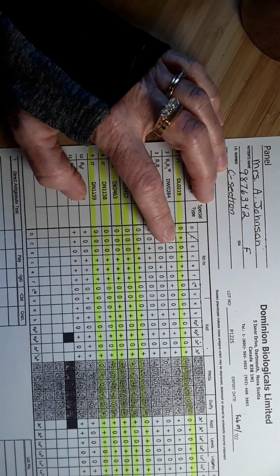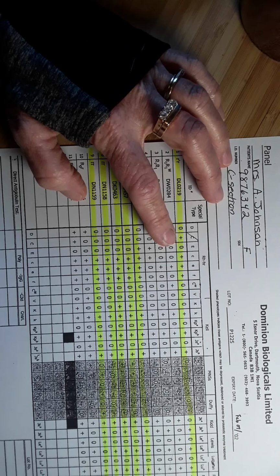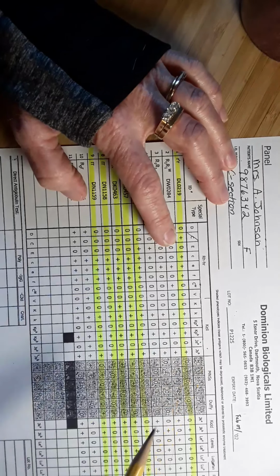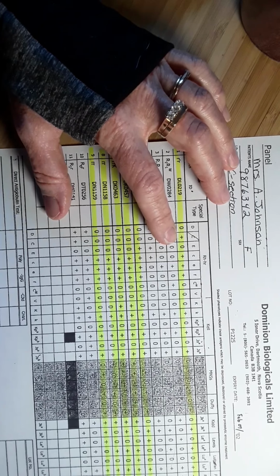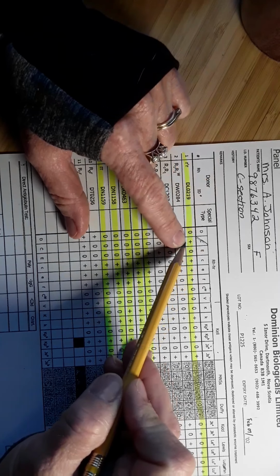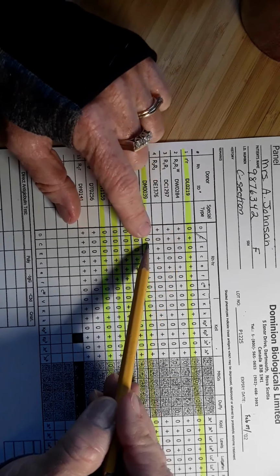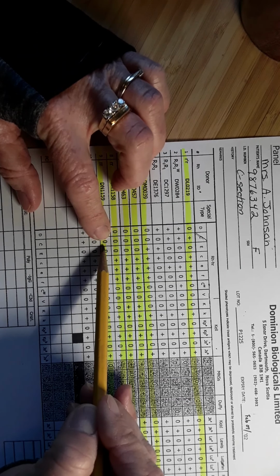The patient's plasma was reacted with a panel cell that has the C antigen on it, and it did not react. This is a heterozygous cell, so that concerns me because perhaps the patient's plasma contains an anti-big C that isn't strong enough to react with a heterozygous cell. So we'll think about that, but I've got one slash because I found this C positive cell that did not react with my patient's plasma. Continue down the column only to the highlighted rows, and I don't have any more C positive cells that did not react with my patient's plasma.